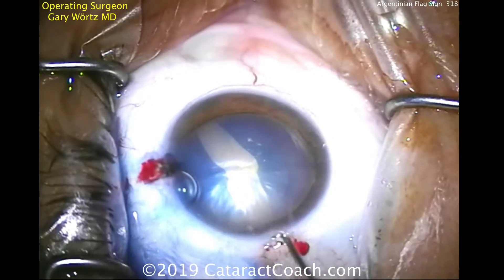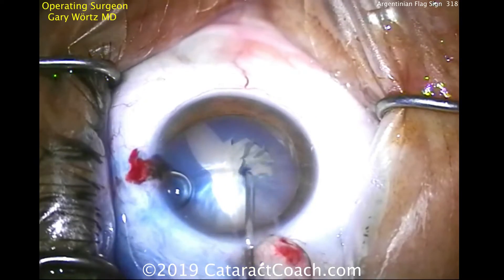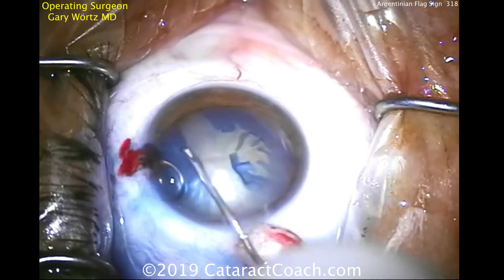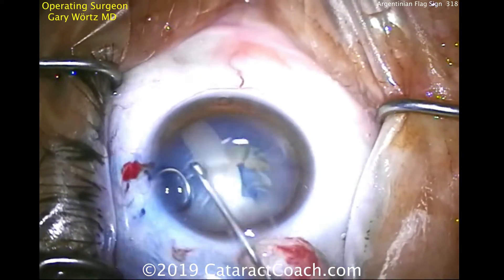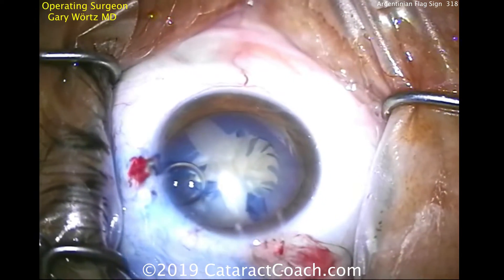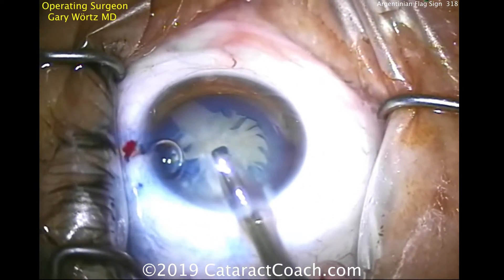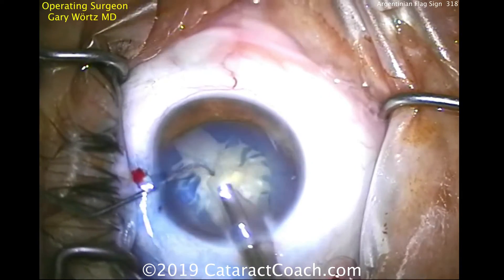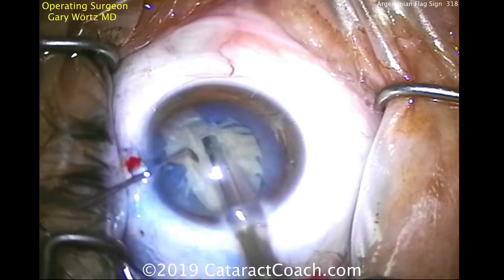Notice how Dr. Wartz doesn't skip a move — he just continues. Now why do a capsule opening like this with the can opener technique? The answer is it creates many different points where stress can be released. If you try to do just a capsulorexis-type opening and you have these two large areas where it radializes to the zonules, manipulation in the bag can lead to ripping of the capsule back towards the posterior capsule. You can have a wide open capsule bag and displacement of the lens nucleus into the vitreous cavity — it can be bad. So by having this can opener technique, he's able to help distribute those forces more evenly.